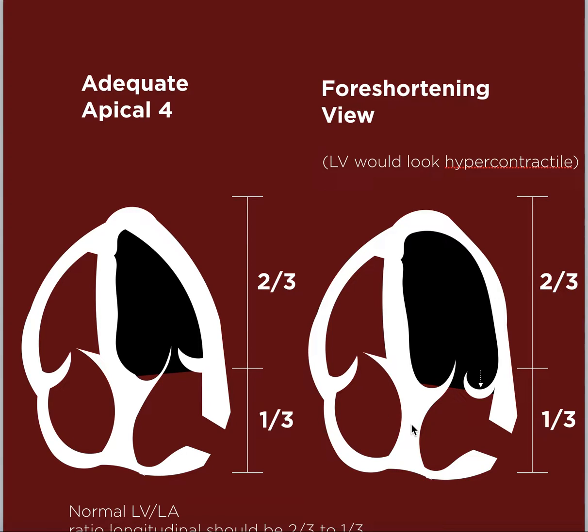A frequent mistake beginners make is placing the probe a little too close to the patient's head. When this happens, the LV loses its pointy end and the LV and LA look about the same size. This is called a foreshortening view.